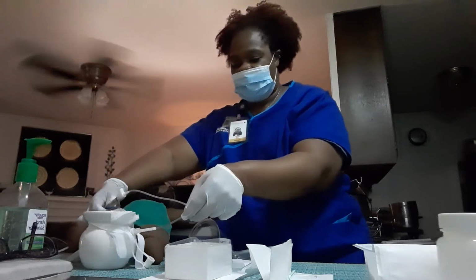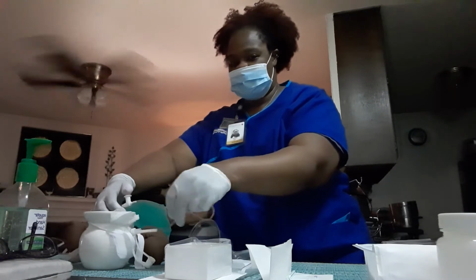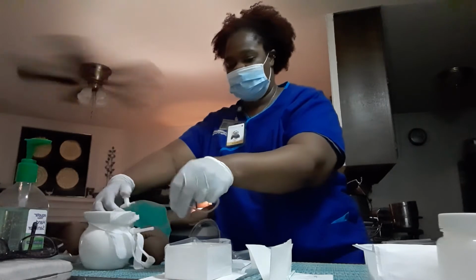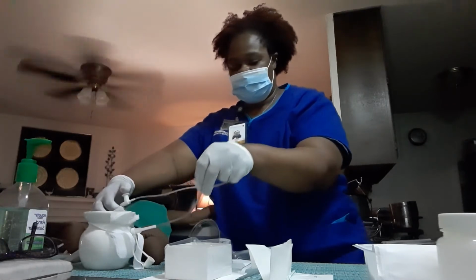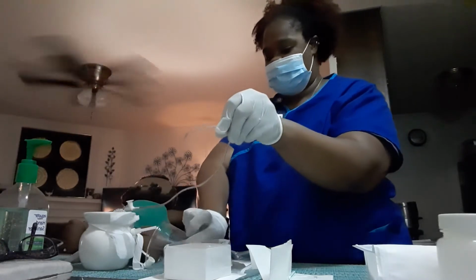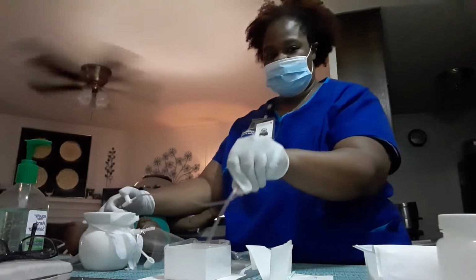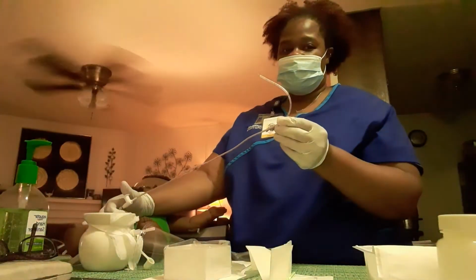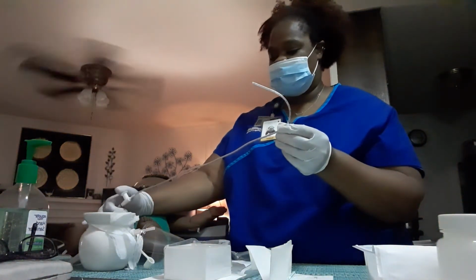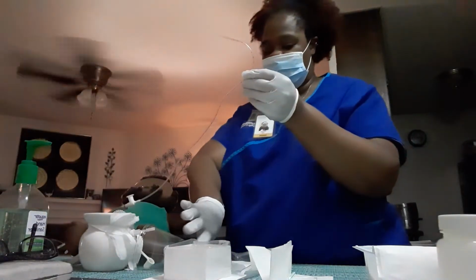I'm going to pull back about a half inch, and then I would start intermittent suctioning, moving the suction tubing around, and I would do this for 10 to 15 seconds. And I would pull out, replace my trach mask. I'm going to clean the suction tubing off. I'm going to give the patient a chance to catch his breath, get some more oxygen in him. Okay, after about 30 seconds, we're going to do it one more time.